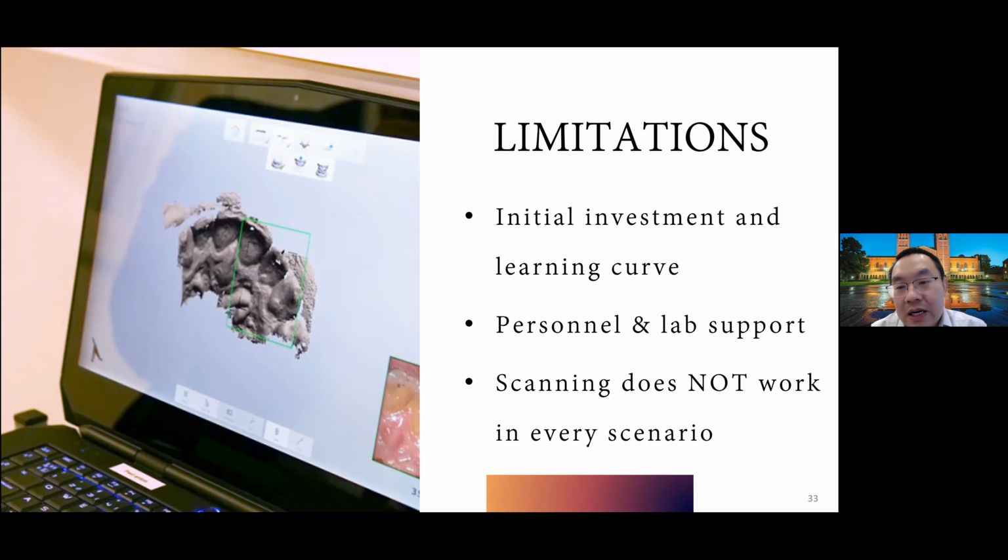But I was encouraged to start thinking about that a little bit earlier. Maybe start thinking about adopting a digital workflow from the start, getting a scanner in your office first, and try to expand on your applications as you go, right? You can always start with a CAD/CAM workflow. As we showed you earlier, it probably takes about 8 months to a year for you to break even. And after that, you're going to make money, right?